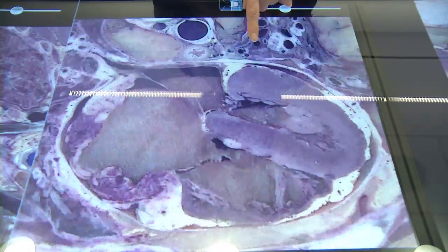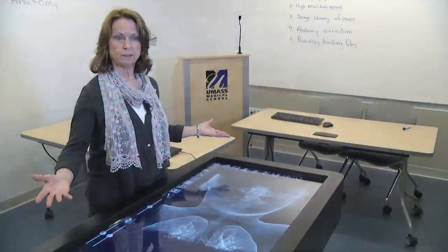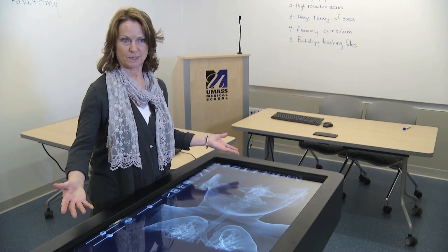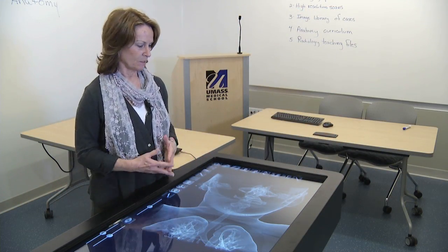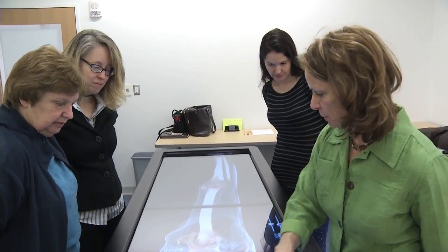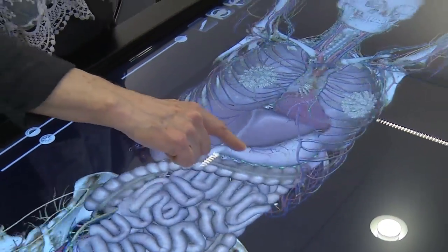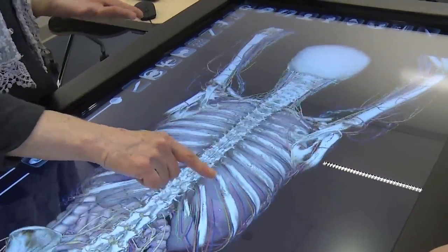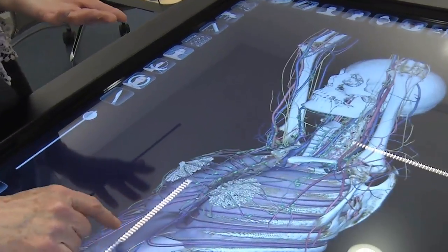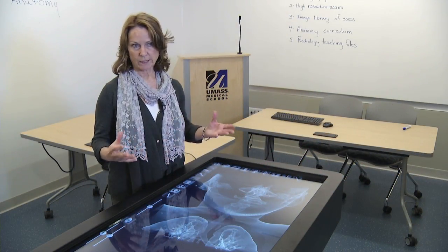We can manipulate it, but this is basically a computer screen. The software the table has allows us to take any image, make a 3D image out of it, and manipulate it — rotate it, cut it, and layer it. We can add layers to each image, we can subtract layers.